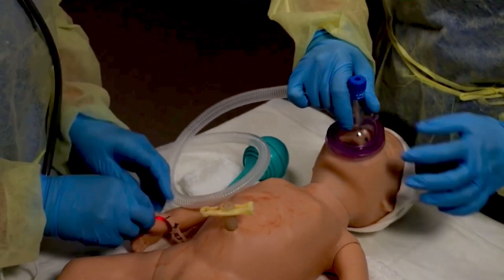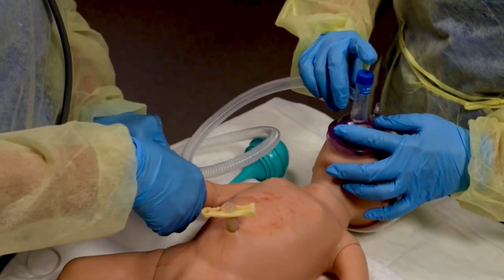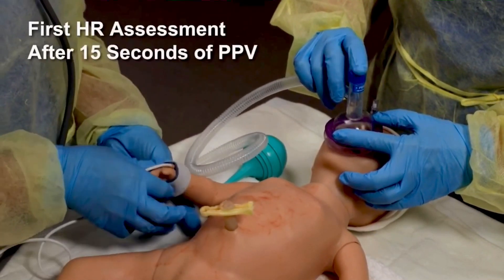Begin PPV in room air, 21% oxygen. Place a pulse oximeter sensor on the baby's right hand or wrist. After 15 seconds of PPV, do the first heart rate assessment.